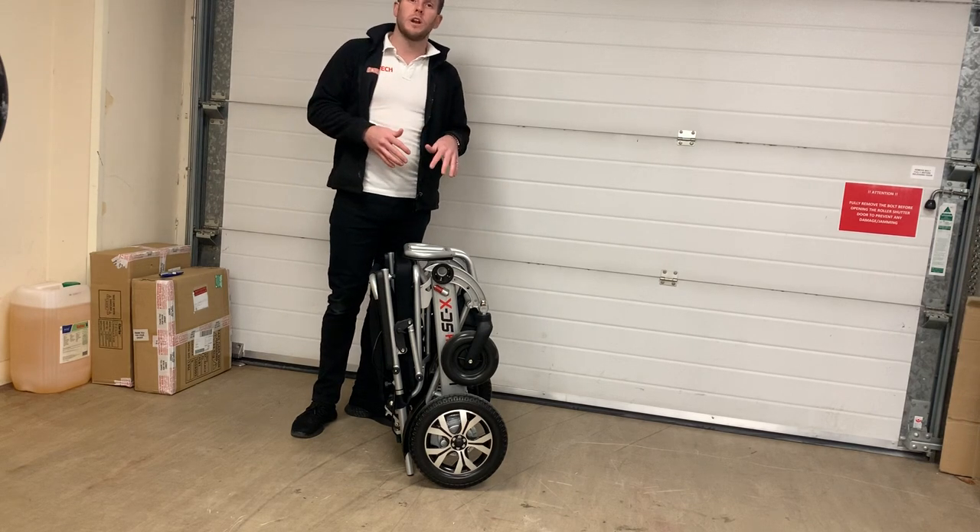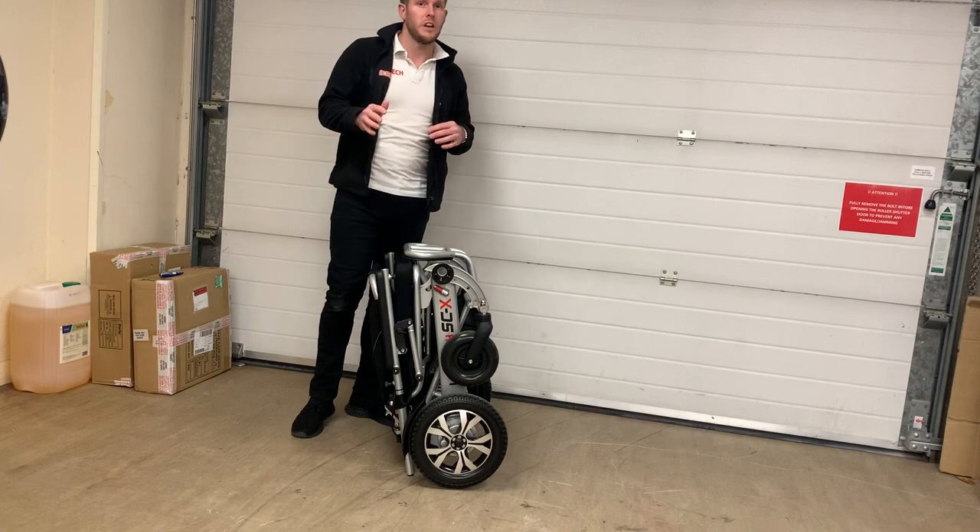It also has the highest ground clearance of any electric folding wheelchair in the whole world.